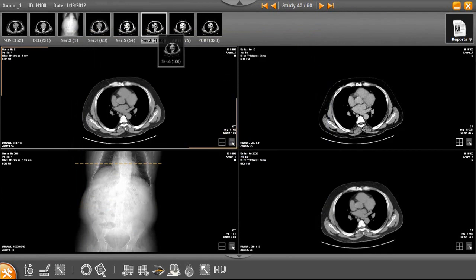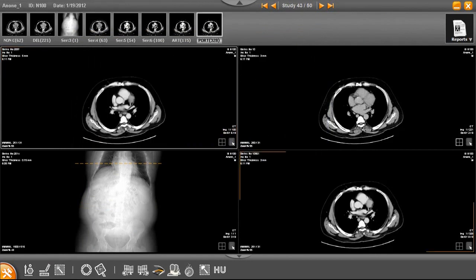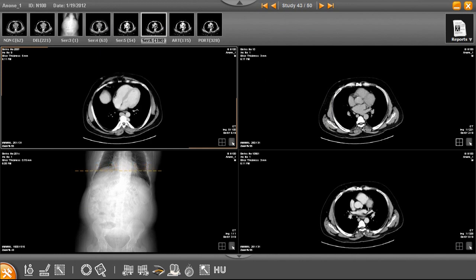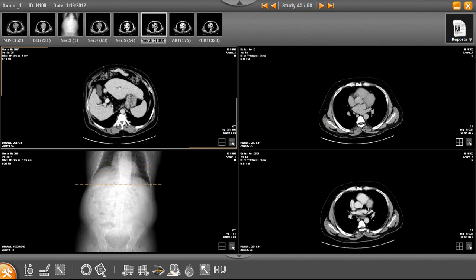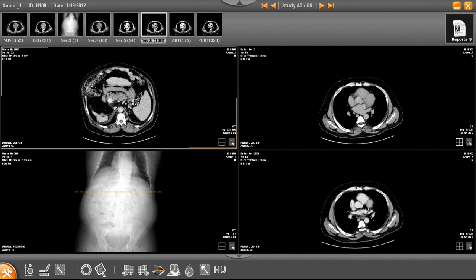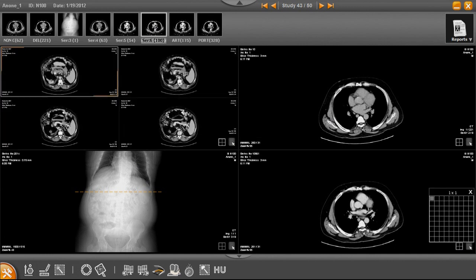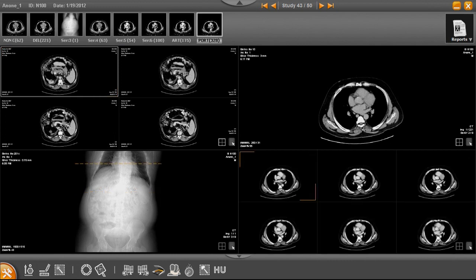The ultra-fast streaming technology makes it possible to stream large studies in seconds without compromising the image quality. The auto-fetch technology enables users to diagnose large studies instantly without having to wait for a complete study to stream. Smart Reading automatically launches hanging protocols based on user preference and modality type, helping to further increase productivity.